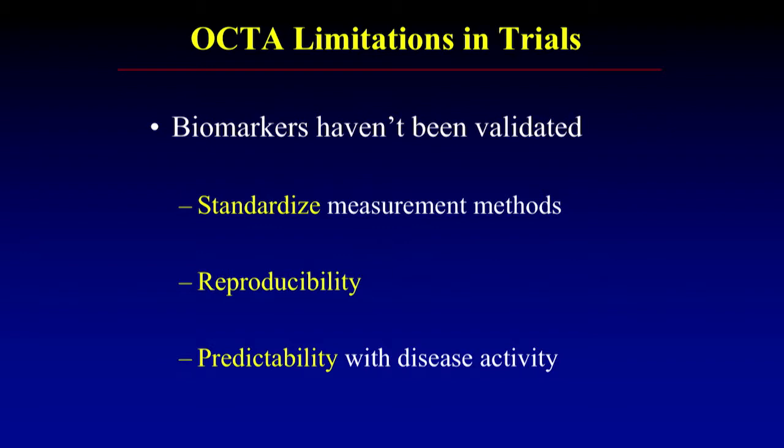The limitations of OCTA in wet AMD are that these biomarkers haven't yet been validated. The measurement methods still need to be standardized. The measurements need to be shown to be reproducible, and they should vary predictably with disease activity. But with the future incorporation of this technology in trials, I think we'll get a lot of this information soon.